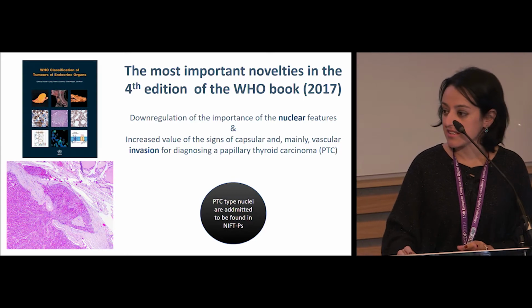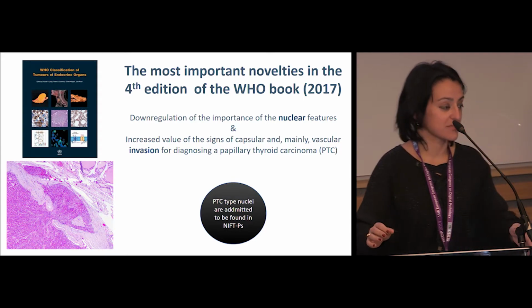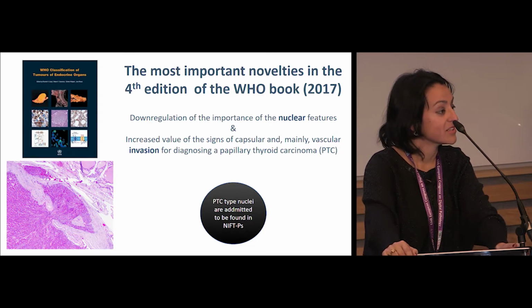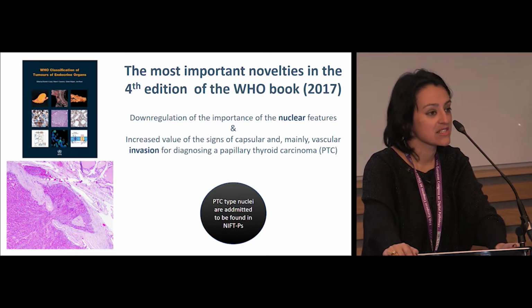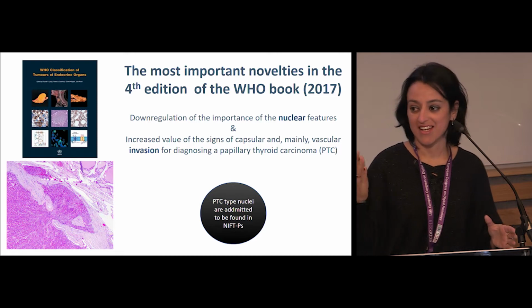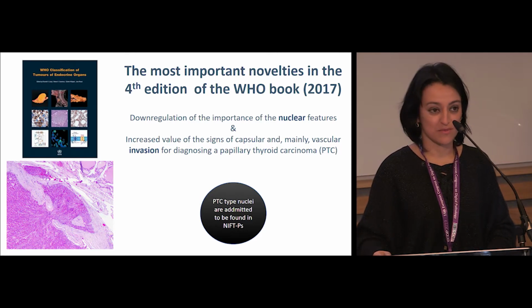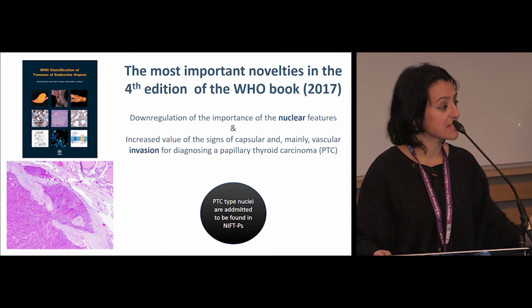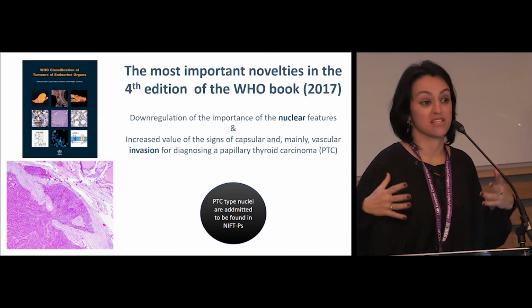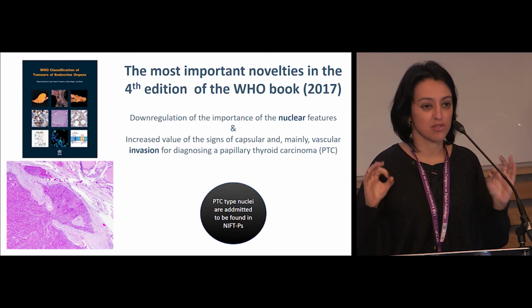To put things even worse, in the last classification of the WHO, two major alterations came into the diagnosis of thyroid cancer. There was a downregulation of the importance of these nuclear features and an increased value in the signs of capsular and mainly vascular invasion. So again, stressing the importance of the invasive fronts, as our previous speakers spoke about. This second part, I will just skip it. It's extremely important, but it will take another talk, so I will just keep with the nuclear features.